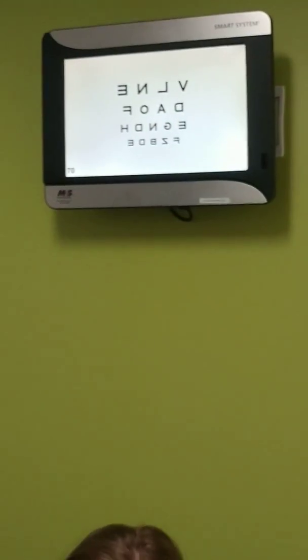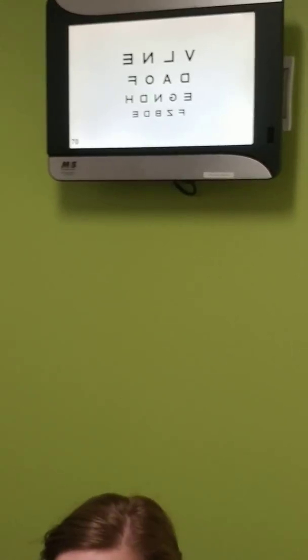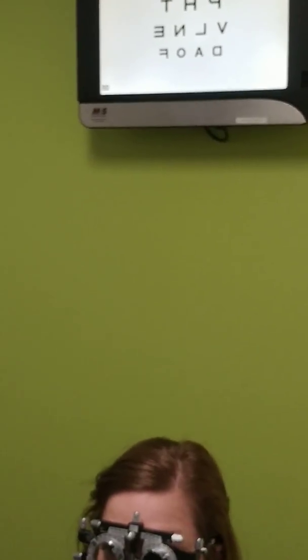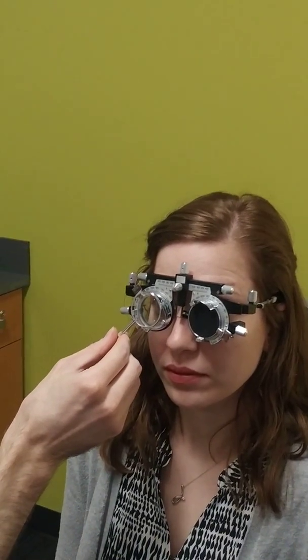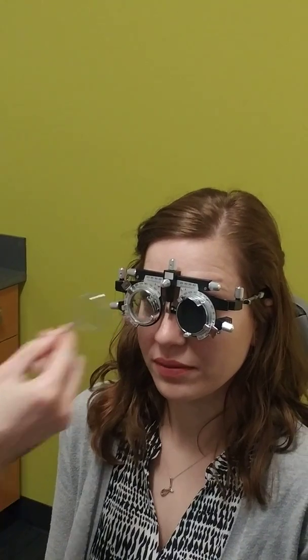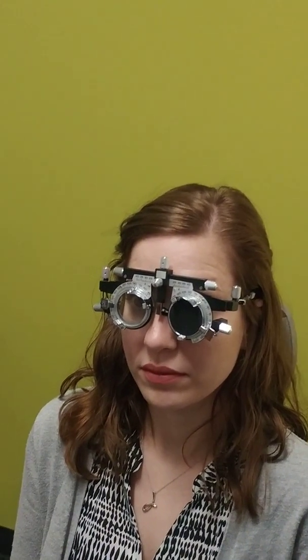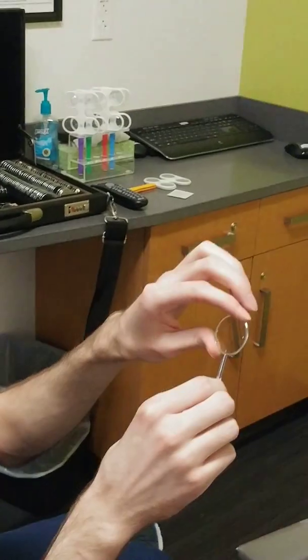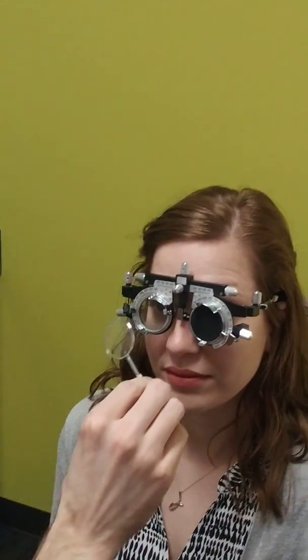I'm going to have her look at something two lines above what she was just able to read — the 20/80 line — and look at a rounded letter. Is it more clear with position one or two? She said two, so the clear was without that orientation. I rotate to axis 135 and check again: more clear with one or two? She said two — more clear with the red — so she accepted the power. Since she accepted the power, I switch to checking axis.